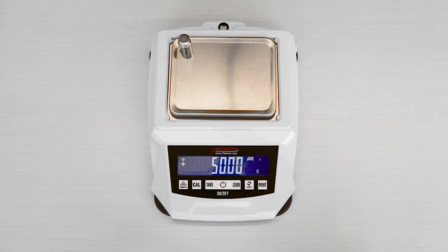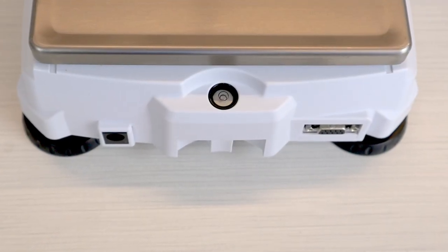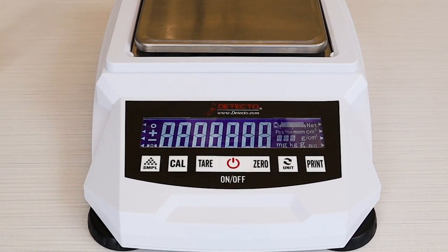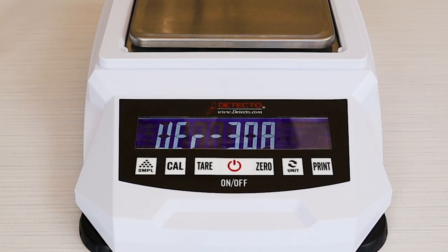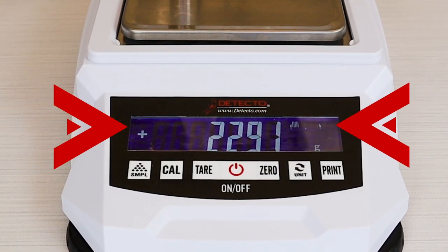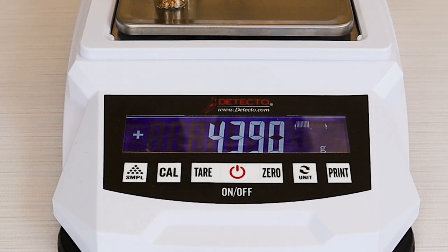Detecto's strong weight bridge design yields optimal accuracy. Four adjustable feet and a bubble level allow you to adjust the feet to bring it into balance on unlevel countertops. The scale has a quick power-up sequence and auto-zeroing. You can see the stabilization icon show up on the scale when it settles. The load bar symbol on the top right of the LCD shows the remaining capacity of the scale from empty to full load.